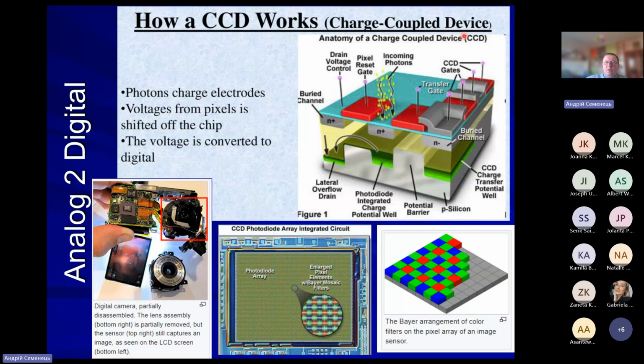Here we talk about the charge-coupled device, which was developed decades ago and allows us to create a sensitive matrix array, which is used for recording digital images of any type, no matter if you are talking about visible light, like the camera in your phone, or a device used for registration of X-ray transillumination.